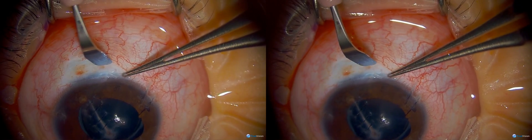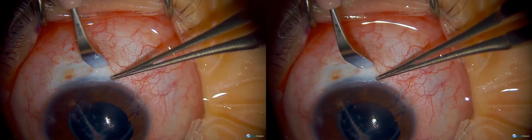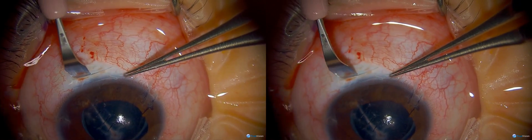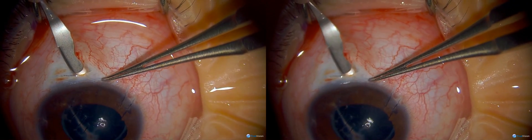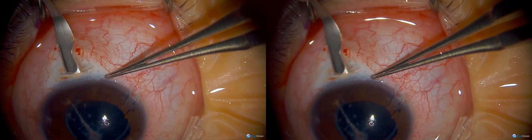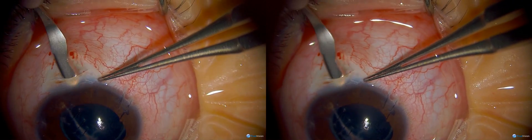I like to do a three-step incision off the sclera. In children, if you do a clear corneal incision, you have to be truly clear corneal or the iris will come out. With a nice scleral incision, the iris tends to stay in. The limbus is about two millimeters; I do about a four-millimeter incision. You want to go flat and tunnel up the sclera until about clear cornea, then leave that alone — it's really just for lens implantation.